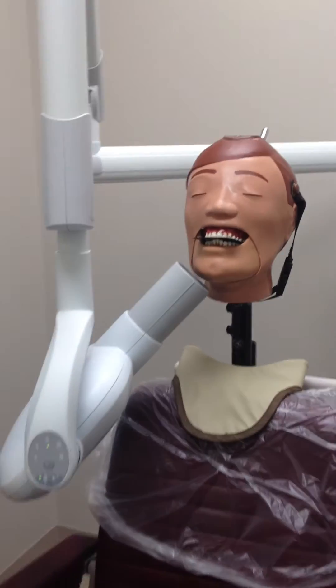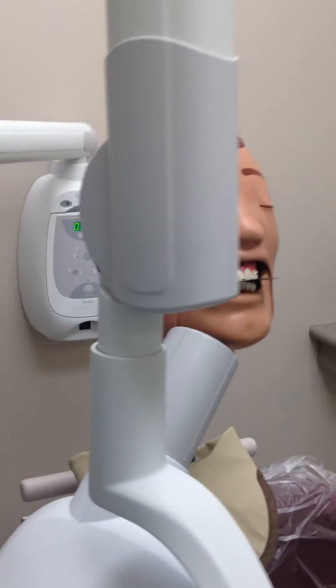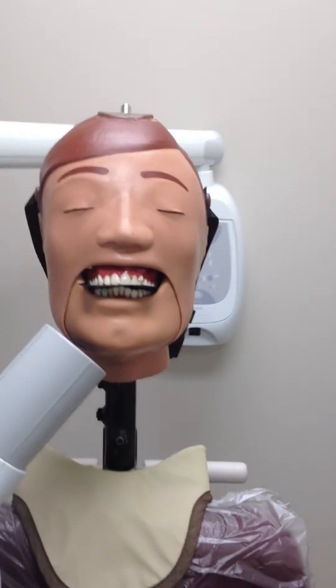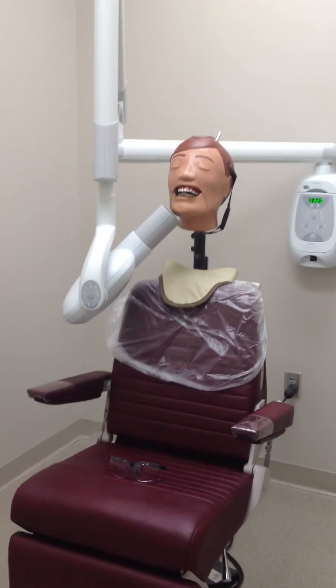After placement of the PID, instruct the patient to remain as still as possible. The exposure is then taken by pressing the exposure switch while standing at least 6 feet away until a beep is heard.